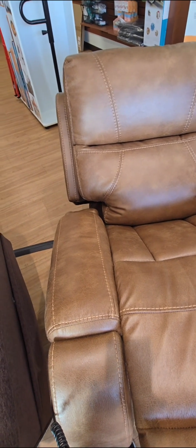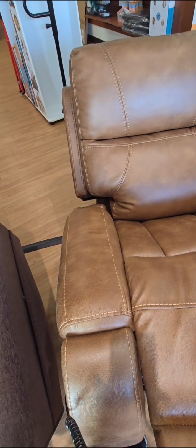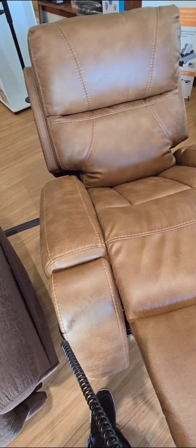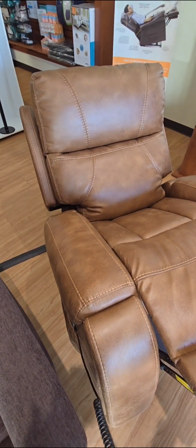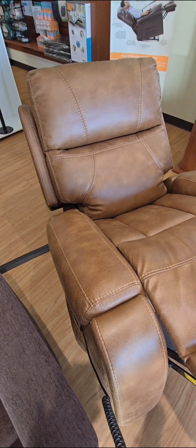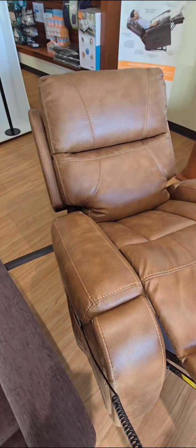And so I can accommodate someone who probably could use a different chair, but might like this chair a little better, but they don't want to have to scoot, or scooting is not the most comfortable thing for them to do. The lumbar will reduce the depth of the chair, and that makes it more comfortable when they're using it. Okay. The other thing to remember, the headrest is great for when someone wants to use their lift chair to sleep in. They can elevate the head a little bit like a pillow and get a more comfortable position for when they're ready to sleep. So you can virtually do quite a few different things with your lift chair.